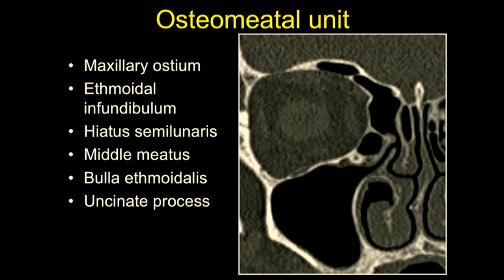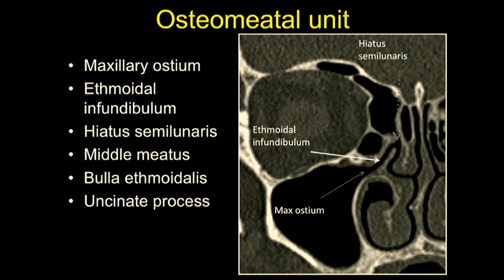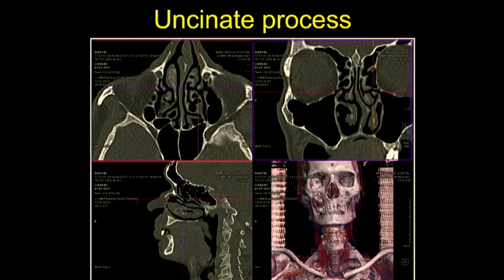Let's begin with understanding the osteomeatal unit. Remember, it's a three-dimensional space — it is not something seen on just one cardinal image. This is the representative cardinal scan which best delineates most of the components of the osteomeatal unit, but it is actually a 3D drainage pathway of all those anterior sinuses. This is the maxillary ostium at the anterior and superior corner of the maxillary sinus, draining via the ethmoidal infundibulum and the hiatus semilunaris into the middle meatus. The uncinate process attaches inferiorly to the inferior turbinate, and the bulla ethmoidalis is usually the largest cell of the anterior ethmoidal group — these are the main components of the OMU seen in this coronal picture.